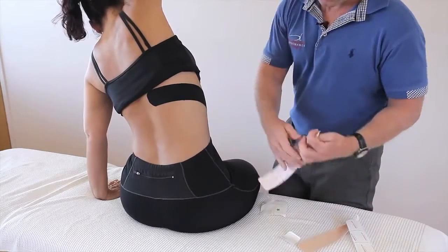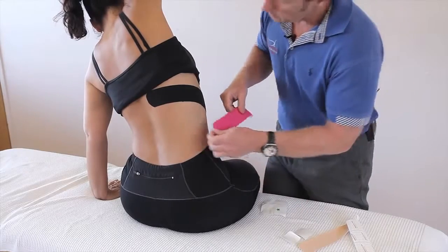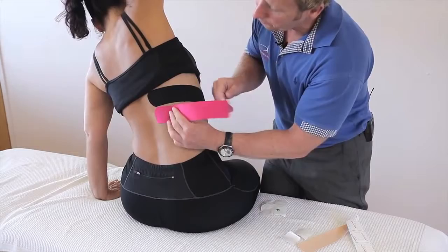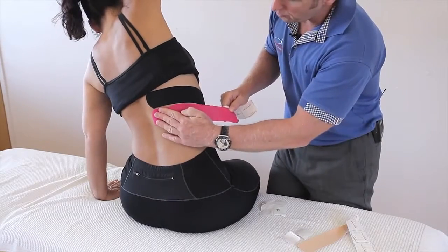If the pain is a bit lower, we can apply the same application of tape, as it's more of a generalized rib pain. Again, about 10% stretch, just bring that over.